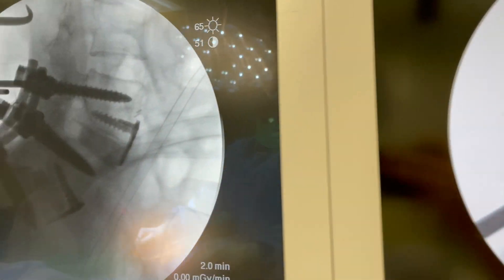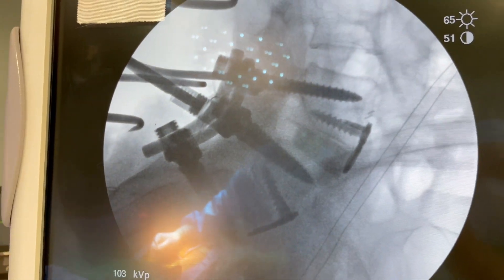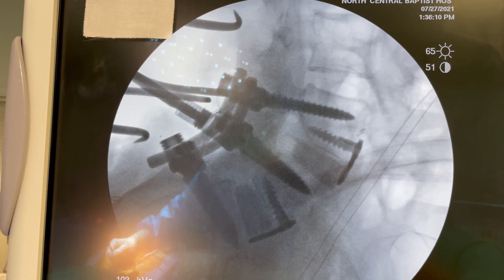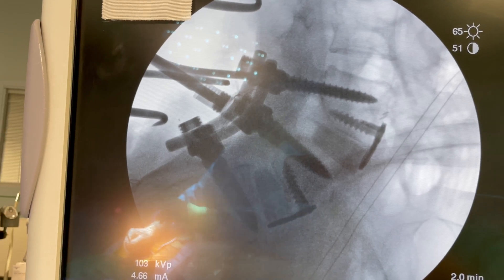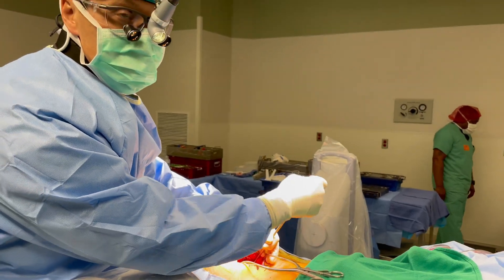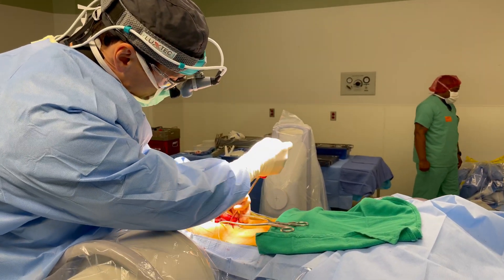On the image on the left, with part of the screws together, the back of the bone is now a lot more close to the back of the bone below it. We're going to tighten that screw and try to get it fully reduced — to realign and replace it in the right position.